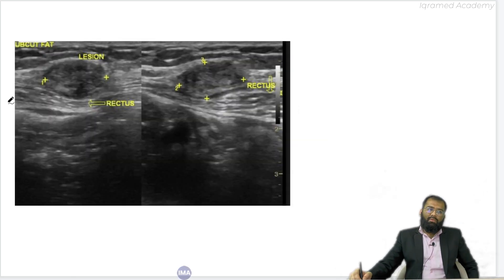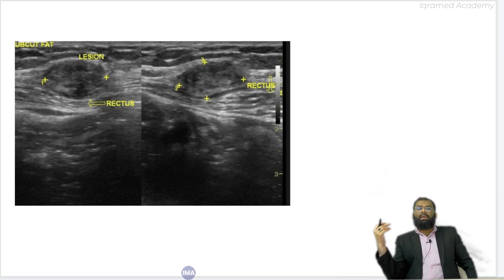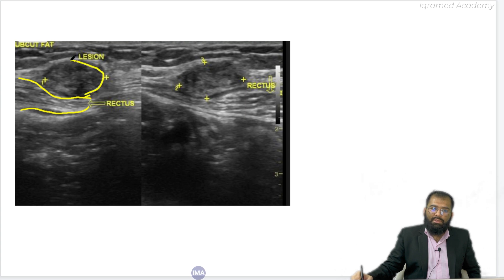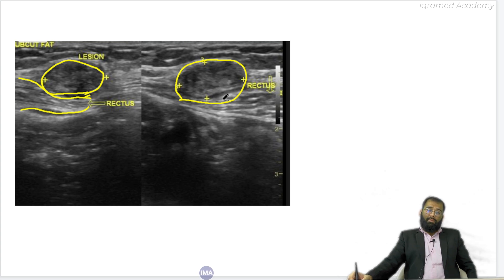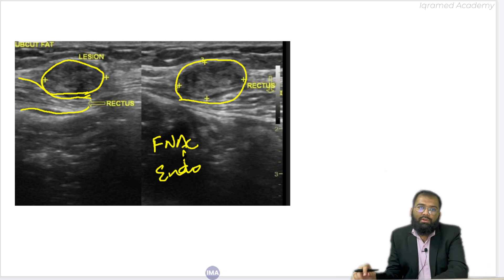This is one interesting case before we start with ovarian endometriosis. This patient presented with repeated pain on menstruation, and the pain was at the site of the LSCS scar. On ultrasound using a linear probe, we could see this is the rectus muscle, and overlying the rectus muscle you are able to see this lesion — a heterogeneously hypoechoic lesion, oval, showing some vascularity within it. This was there within the subcutaneous tissue overlying the rectus at the level of the LSCS scar. We did FNA and it turned out to be scar endometriosis — endometrial tissue within the scar. This is one of the common types of endometriosis which can be encountered.